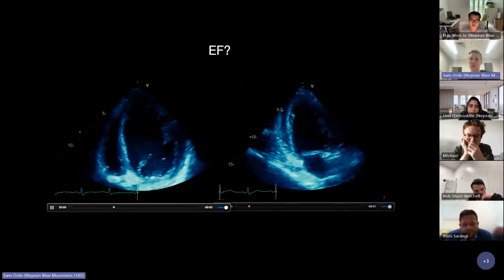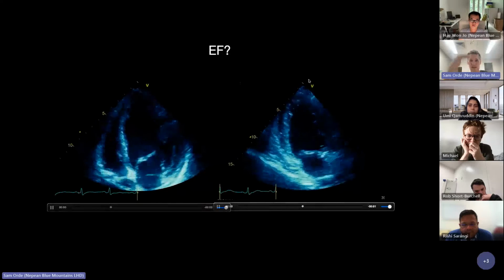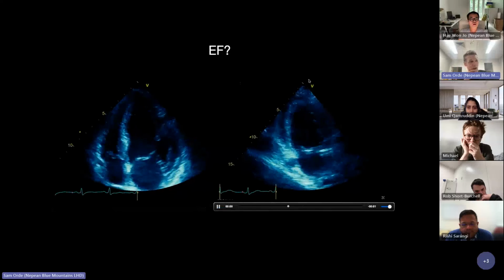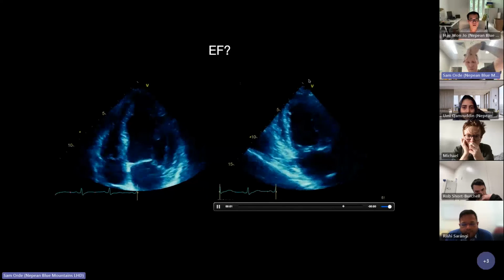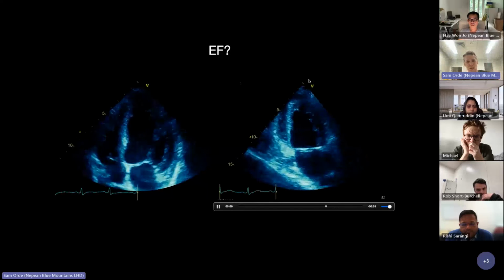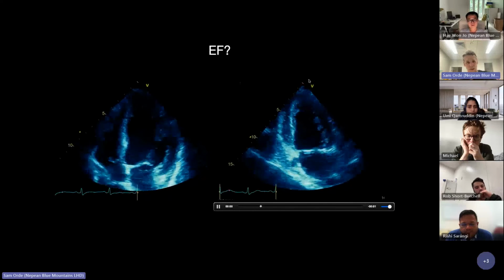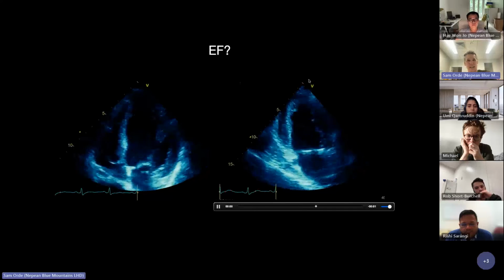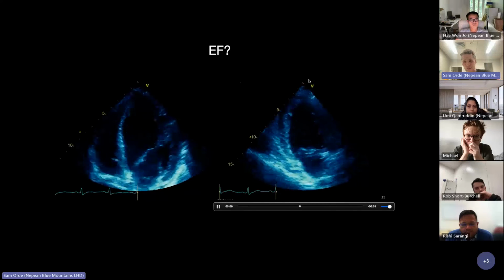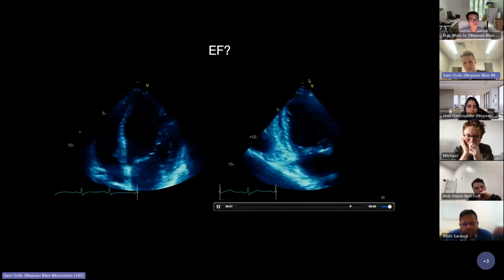You probably see it better in the 2-chamber. Can you see how that apex is moving down the whole time? If it's moving down the whole time, it means that you are off axis. You're not imaging from the true apex, you're imaging from the side, you've foreshortened the image, so you are not going to be estimating the ejection fraction in the appropriate manner. Can you make a kind of guess at what systolic function is? Sure, it's subjective at best. Just don't make measurements, okay?